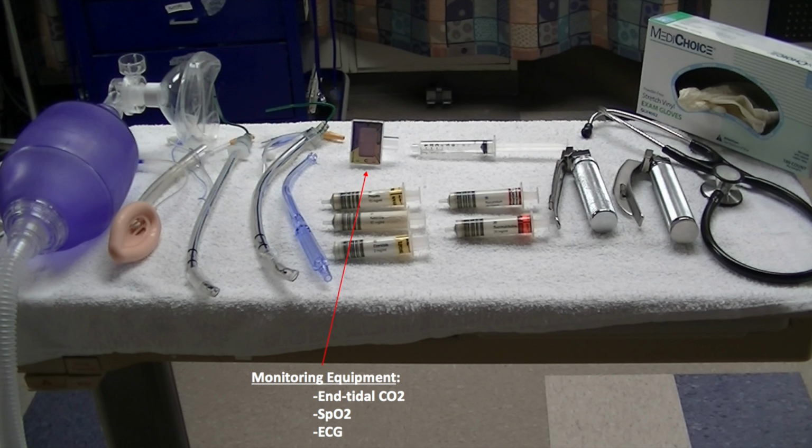One piece of monitoring equipment to remember is the end-tidal CO2, which will confirm successful intubation. What you see here is a color change device, which is a pH-sensitive chemical indicator that changes color from purple to yellow when exposed to CO2. This device connects to the endotracheal tube and will allow confirmation of the ET tube in the airway.